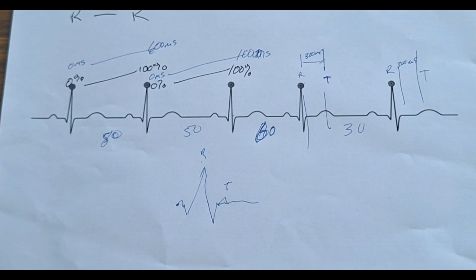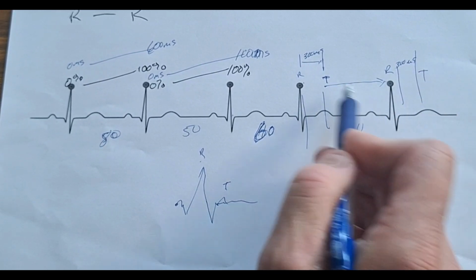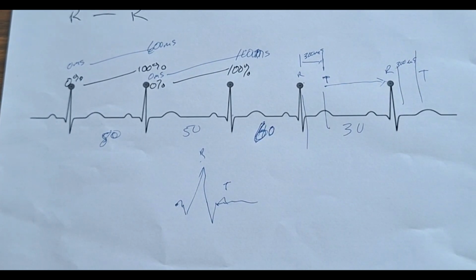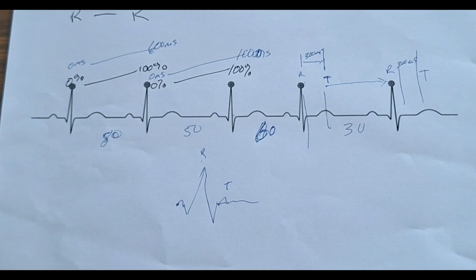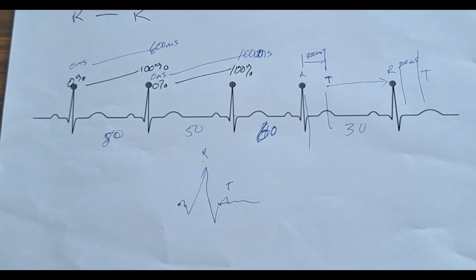That's huge to know. Now your time difference changes from the T wave to the next R wave. This is where time changes. This is why you do not really want a millisecond scan over in the diastolic area, because depending on the heartbeat, if let's say I set a window for radiation to be around 700 milliseconds, I wouldn't have even caught it in this one. And in this one, it would have been way early.